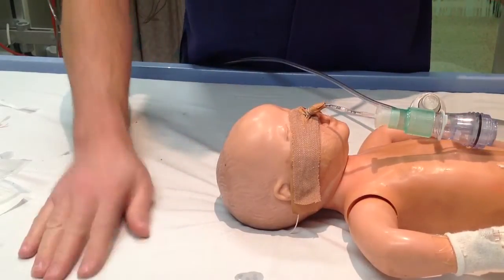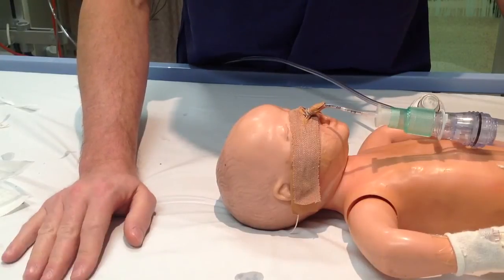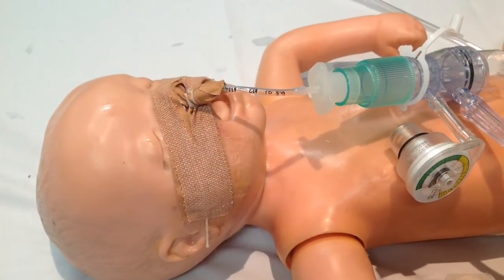And that's it — that's nasopharyngeal CPAP in the paediatric patient.